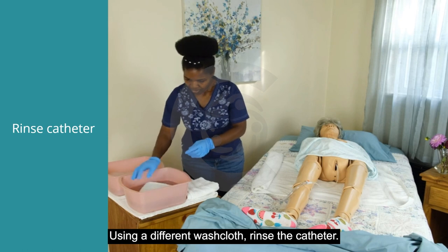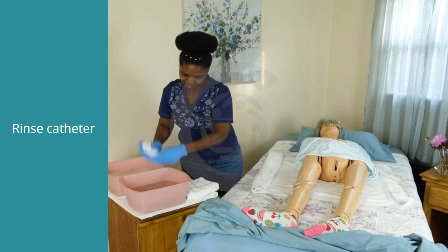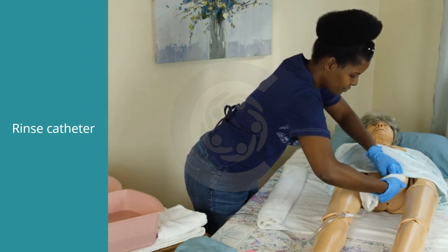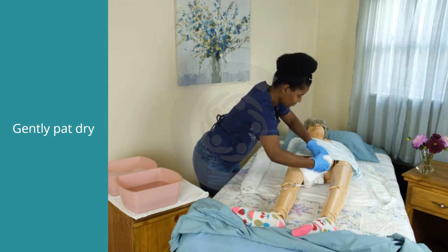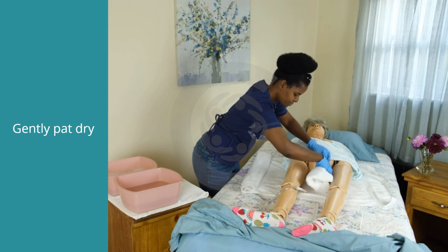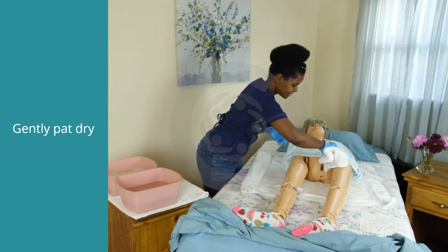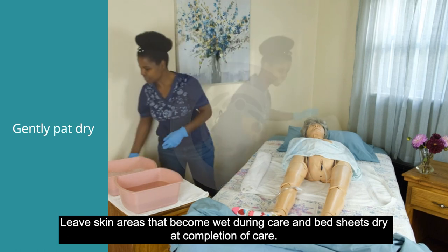Using a different washcloth, rinse the catheter. Rinse at least 4 inches of the catheter nearest the opening, moving from the opening downwards away from the body. Change the spot on the washcloth for each stroke. Gently pat dry any areas of your client's skin that have gotten wet. Leave skin areas that became wet during care and bedsheets dry at completion of care.